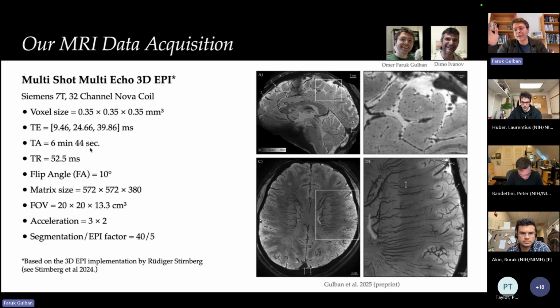So we're talking about 40 minutes to acquire T2 star weighted data, and we came down to basically 7 minutes, right? And 7 minutes, you can really live without too much worrying about head motion during the scan, maybe not in the clinical context. You can instruct your participants well, and make them comfortable, and it just works. So now we went ahead and collected such data at 7T in Maastricht.